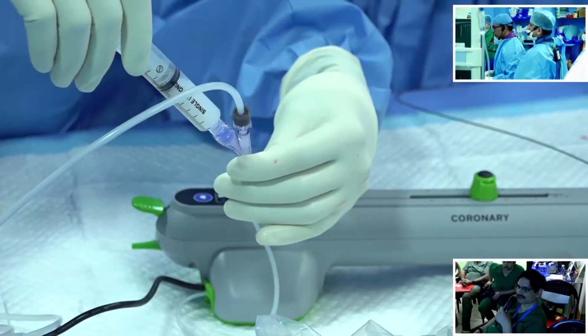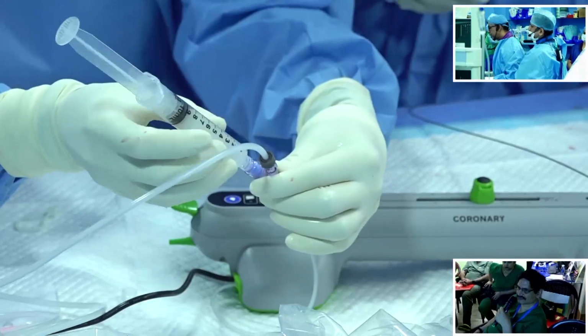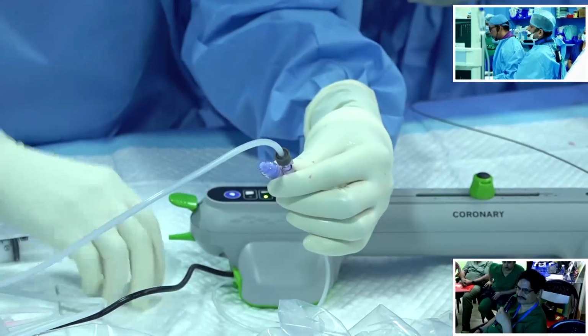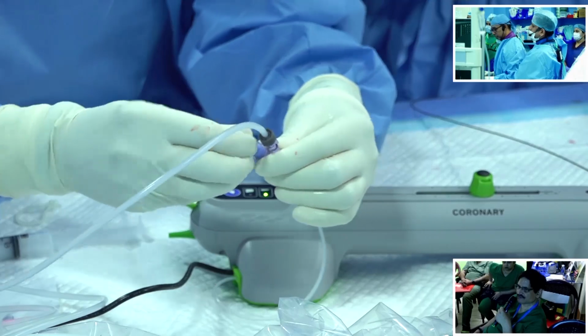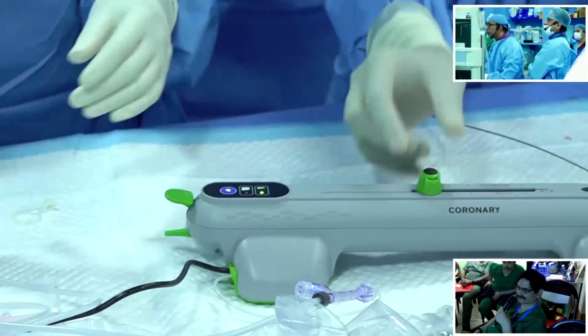You can see how the bubbles will be removed. That is just to remove the air bubbles from inside the tubing. Then they will close with the knob. Okay, now show the connector here. Can you focus onto my hand?